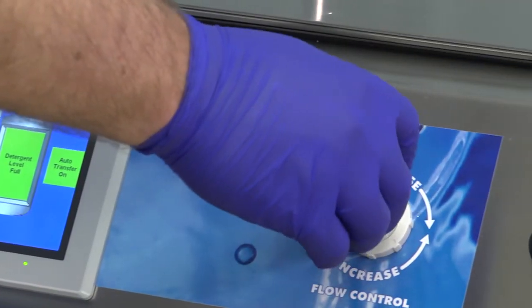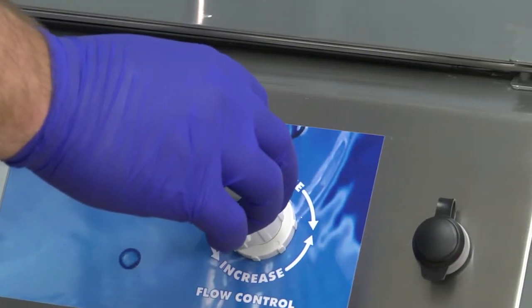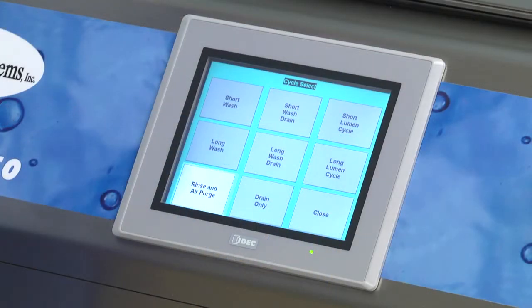Once a lumen wash cycle has started, you can adjust the flow control as needed. The Rinse and Air Purge button can be used when you want to perform an extra rinse and air purge. Drain Only simply empties a basin that was left full.